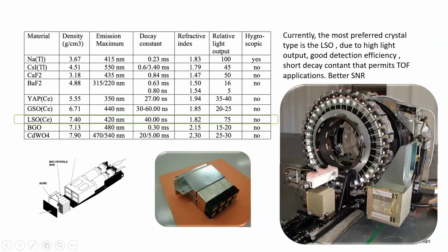Again, I want to highlight the detectors. This is a more exposed gantry of PET. You can see the detector as blocks. Actually, the scintillator detectors that make up the ring are known as a block detector. Each has 4 photomultiplier tubes.